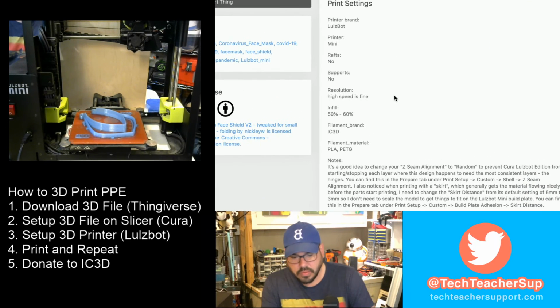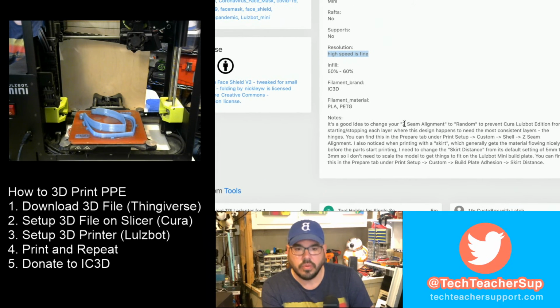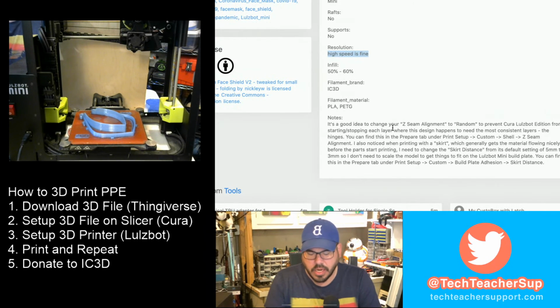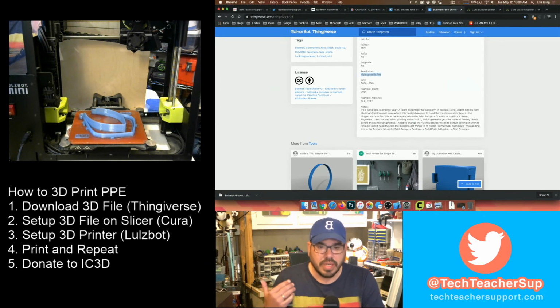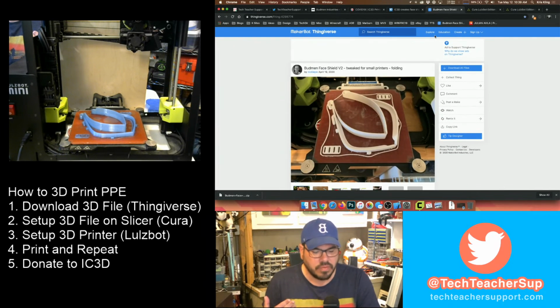So you should not use supports. High speed resolution is fine. You should use PLA or PETG. And then there's some other notes in here. Change your Z seam alignment, change your skirt distance, all right? And again, if you want really more in-depth detail about those specific settings, you can watch my previous video.